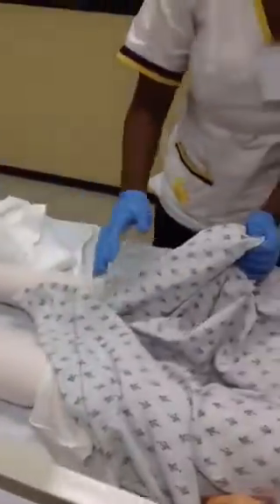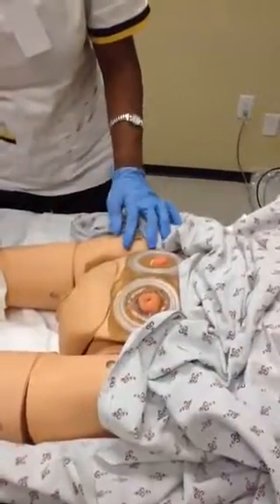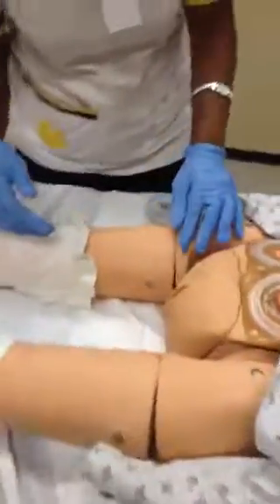I'm going to expose it just for a little bit. Okay, now I'm looking at the urinary meatus. It looks clean. No abnormal drainage.